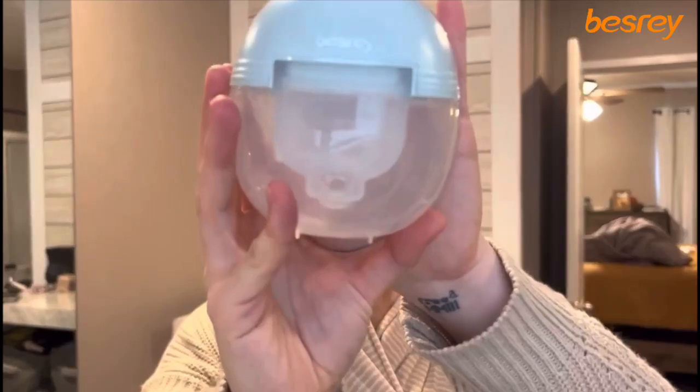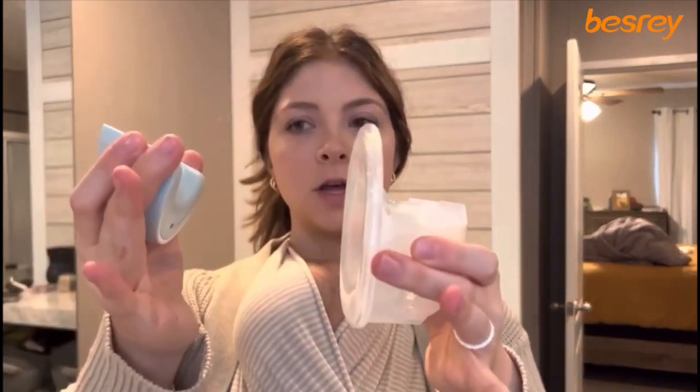I wanted to talk about these Besrey pumps and I absolutely love them. I've been using them for a few days and they're really, really good. I'm a sucker for a good hands-free pump because I hate being plugged into a wall. These are honestly one of the best shapes — they don't have any extra bulk, they're super sleek, it's easy to take off the motor, and easy to pour into a cup. They're easy to stick in your bra too.